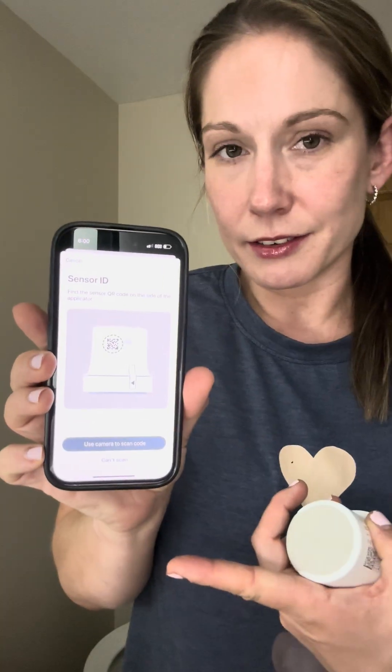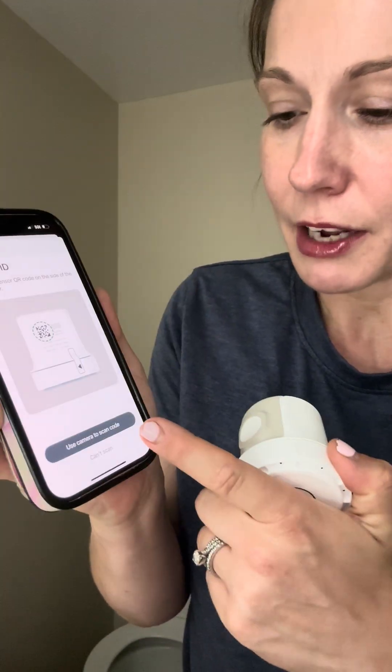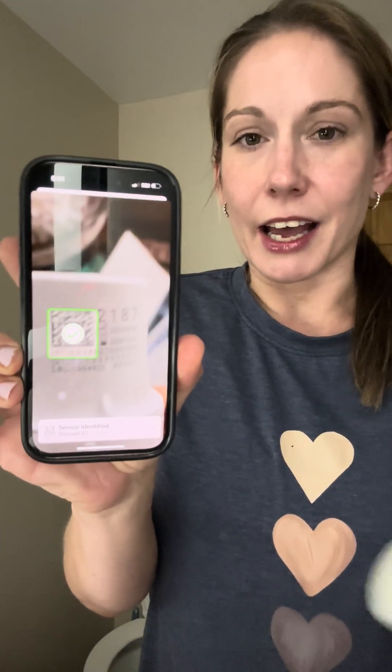Now it's going to prompt me to put in a new sensor. One thing I've been doing recently is scanning that QR code — it has just made things so much easier. Before, I used to type in the code: it requires you to put in the four-digit code at the top, and then the code in the middle that starts with '21.' You can still do it that way, but I've been doing it with the QR code. All you have to do is scan it — I'm going to hit 'Use Camera to Scan Code.' If you don't want to do it that way, you can hit 'Can't Scan' and it will prompt you to put those digits in. Just like that it identified all the information it needs from the sensor.